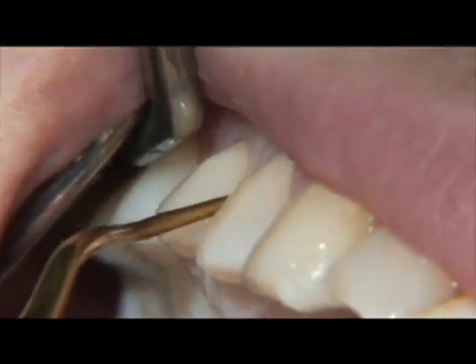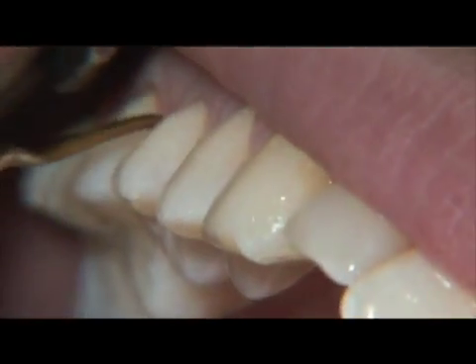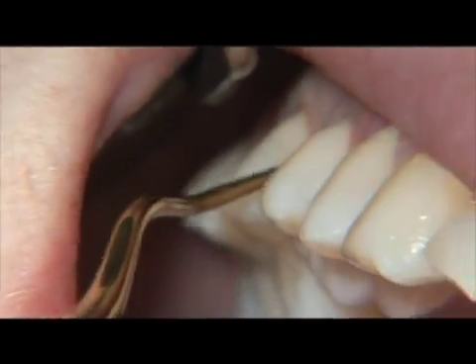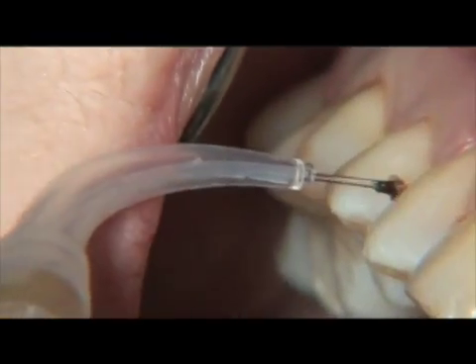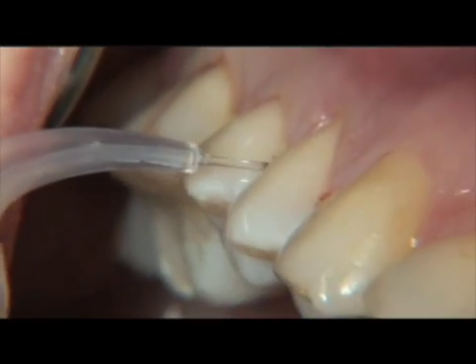Hand instruments are now employed to refine the subgingival surfaces of the tooth. The next step that we will demonstrate in laser periodontal therapy is laser curettage.